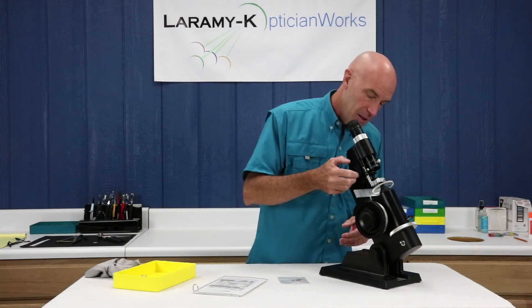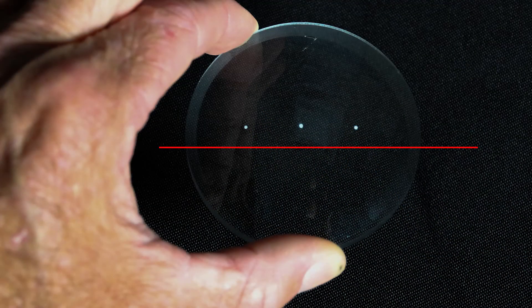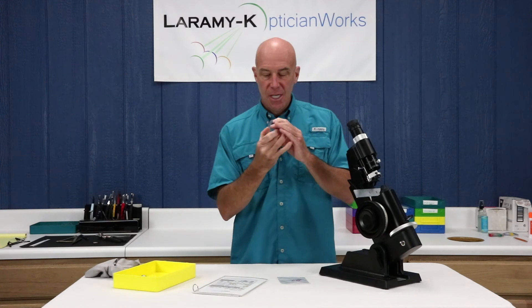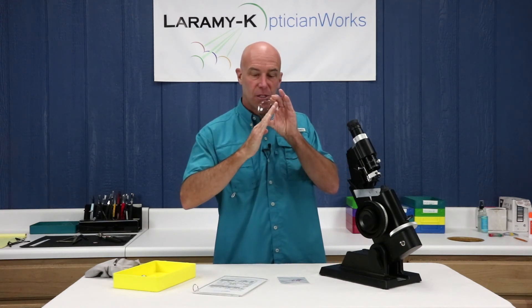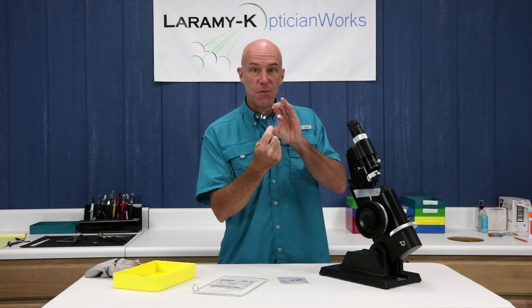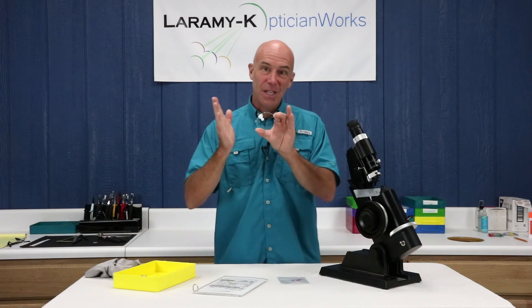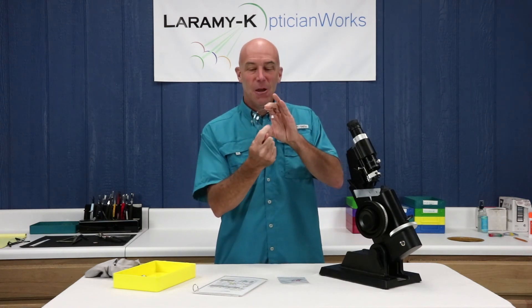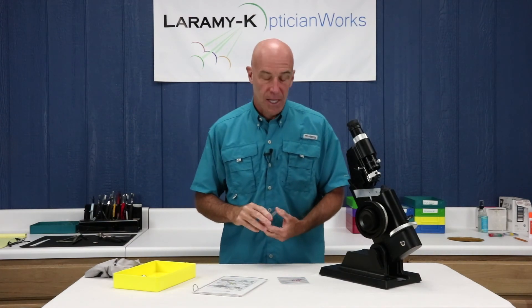I can dot this lens. The center dot will represent my lens OC. The two outer dots are orientation marks — they help me keep this lens positioned correctly so that 48 remains at 48 degrees. If I didn't have those, I could turn this lens and then 48 becomes 58, 68, who knows? Those marks keep the lens on axis through the rest of the process.